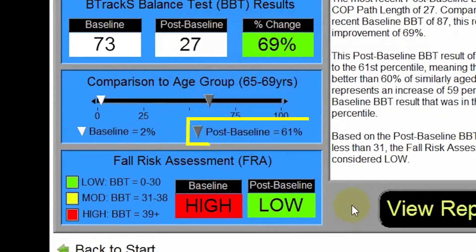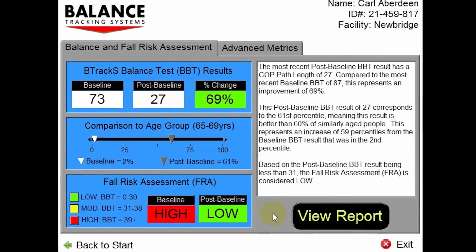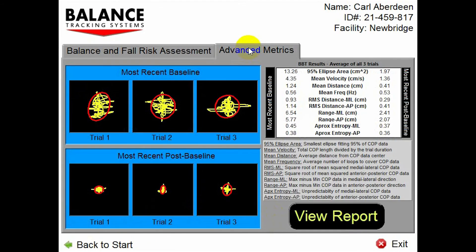The percentile ranking is 61st, meaning this result is better than 60% of comparable adults. Compared to the baseline ranking, which was in the second percentile, it's an improvement of 59 percentiles. The fall risk assessment is low, compared to the baseline result which was high. In the advanced metrics, you can see how the size of the path length has changed from baseline, represented by the red ellipse that covers 95% of the path length trace.